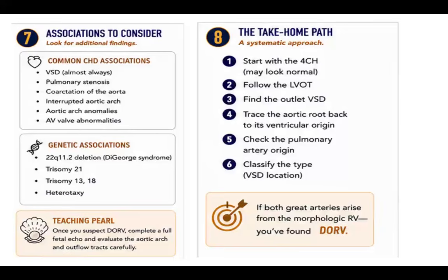Okay. Once you suspect that there is double outlet, of course, we will have to perform a fetal echo in that case and do a full evaluation of everything.